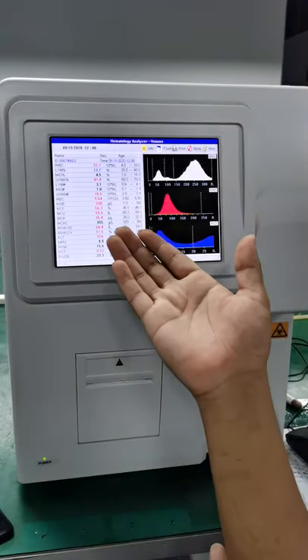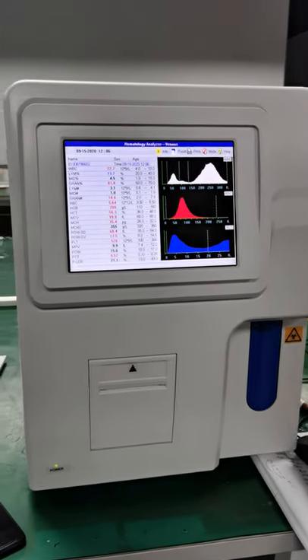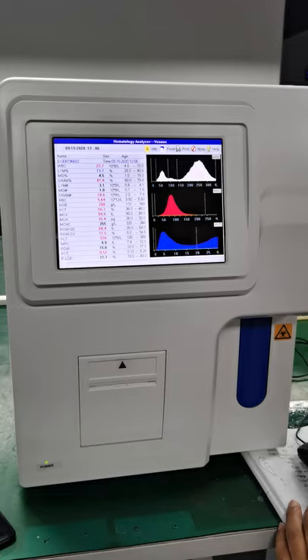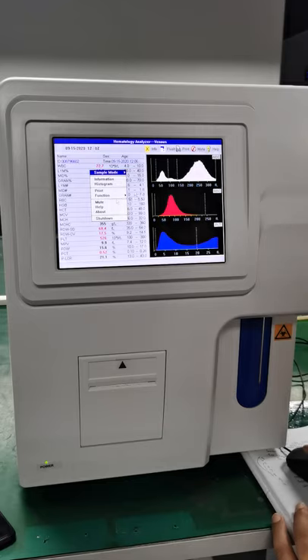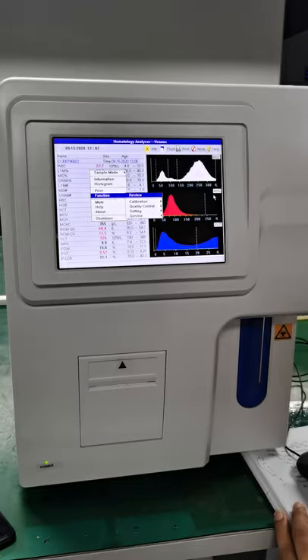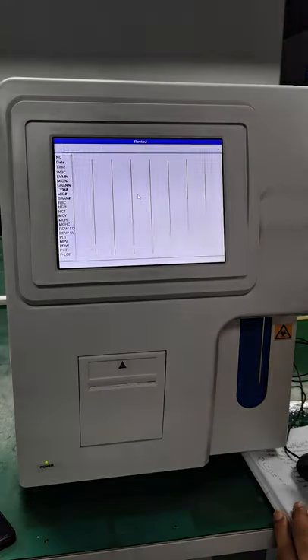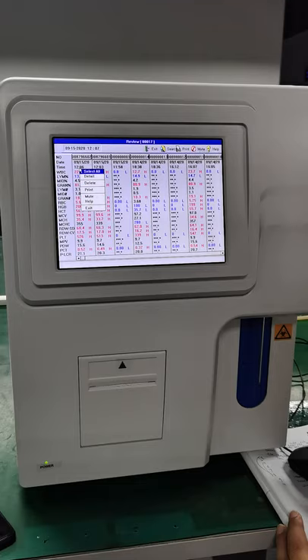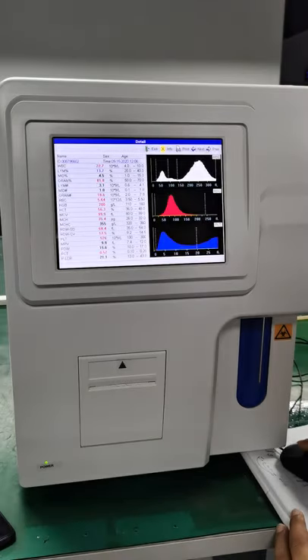Okay, we have this result, but just see carefully, we do not have the information about the patient, right? No name, no sex, no age. So I'm going to show you how we can do this, okay? Let's right click it. And then we go to the function, and then we go to the review, okay? And you can see this is the result we just took, right? We took it at this time, right? Right click it, and then detail, okay?